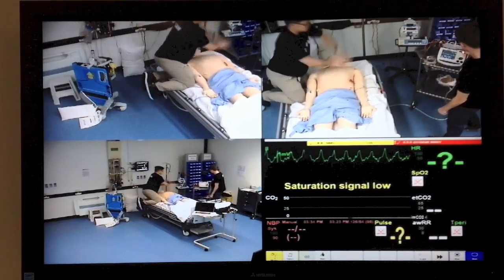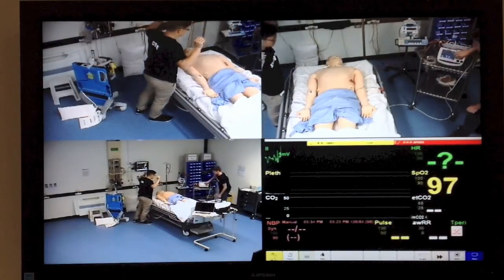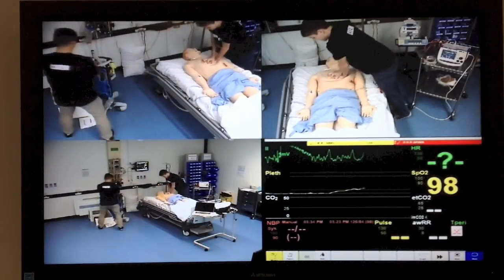It's hands off. Check rhythm. It looks like a VF — shock delivered. We'll get the autopulse on now.